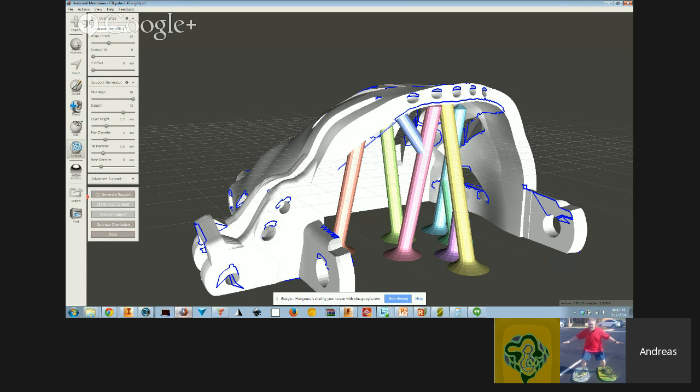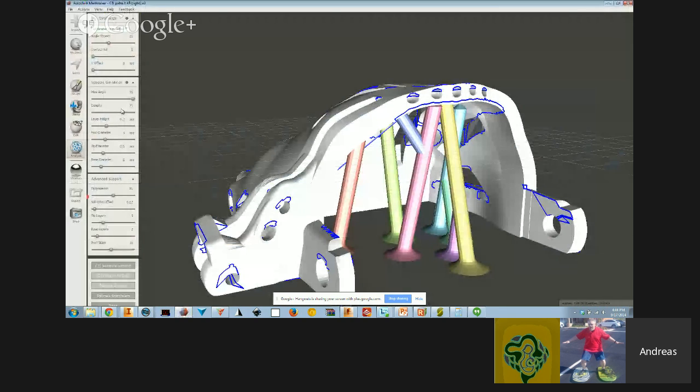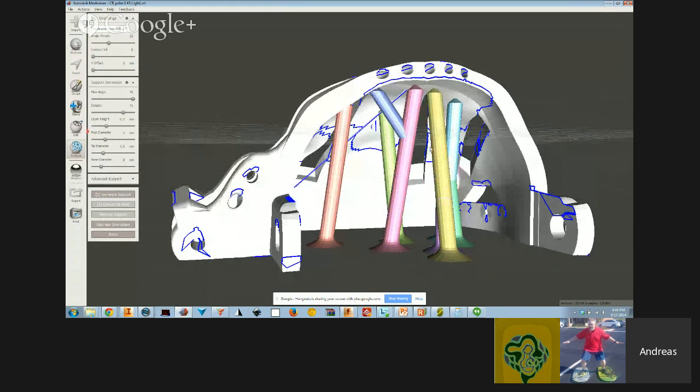Should we go further on this? I can get into some of the advanced stuff, but for a digestible session, and for solving most people's support issues, this is a good place to start. The one final thing, getting back to the initial question: when I moved my object, my support didn't get exported. In this case, what I want to do is convert to solid, which is new within the last release or two. Convert to solid has improved print success considerably, because when it does the toolpathing, it has to do all these little sharp corners and things like that.